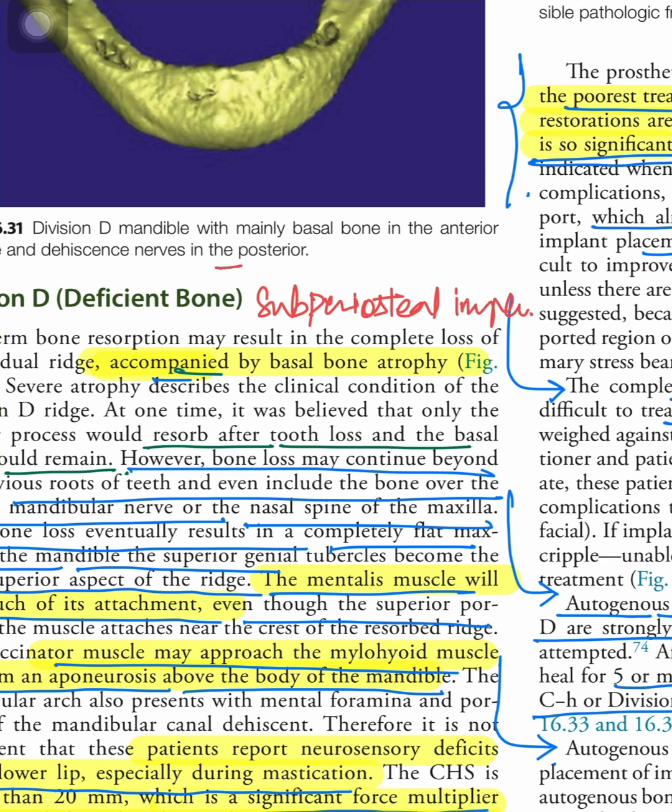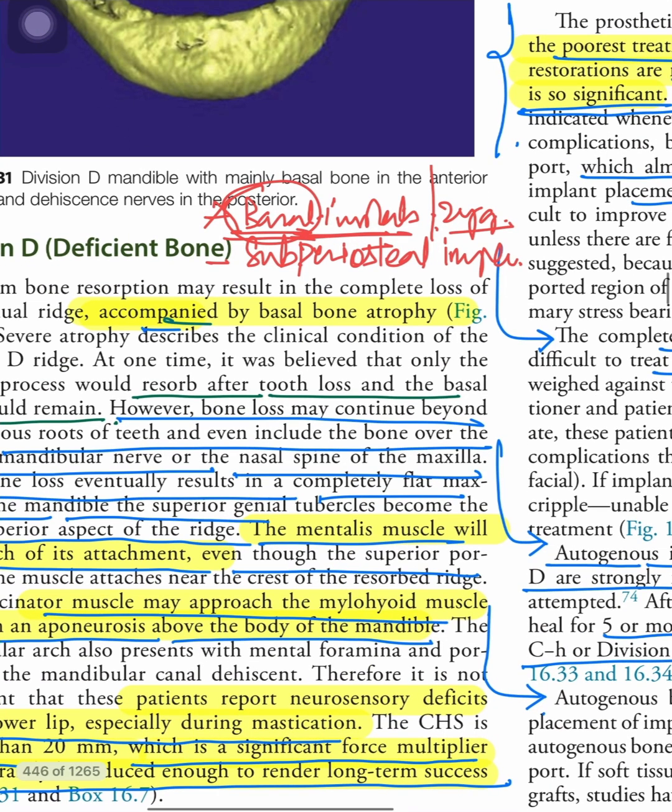I am not sure about basal implants, but you can just read about it, or you can go ahead with, in maxilla, zygomatic implants and other remote anchorage implants anchoring the nasal bone.